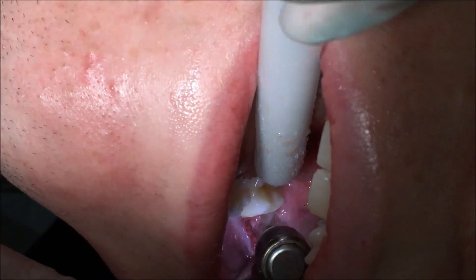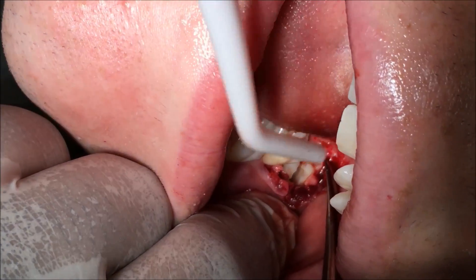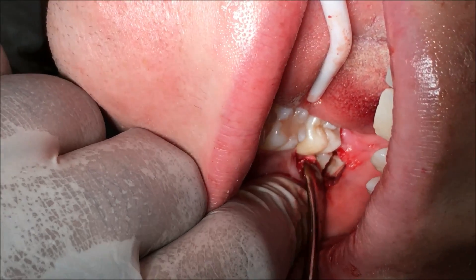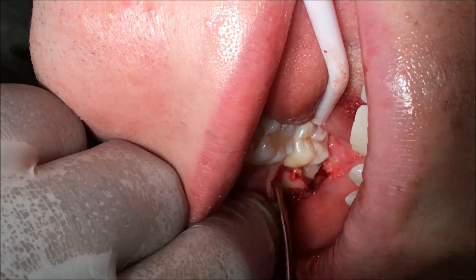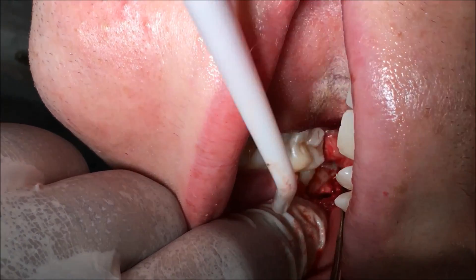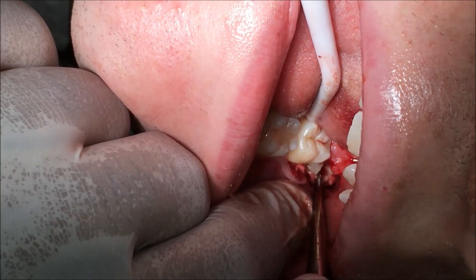When you're sectioning and getting into the furcation, you'll feel the burr drop into the furcation. The IDN is not really close at all here, so it's a fairly safe sort of extraction. I can afford to be a little bit conservative with how much of the tooth is actually sectioned, because apical pressure when separating the roots is not a big issue here given the nerve is so far away. The closer the nerve was, the more I'd ensure that the section had happened.